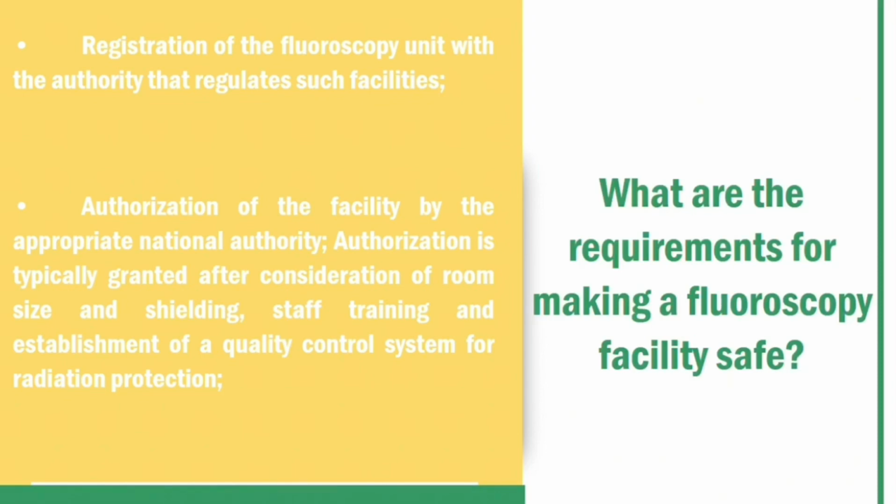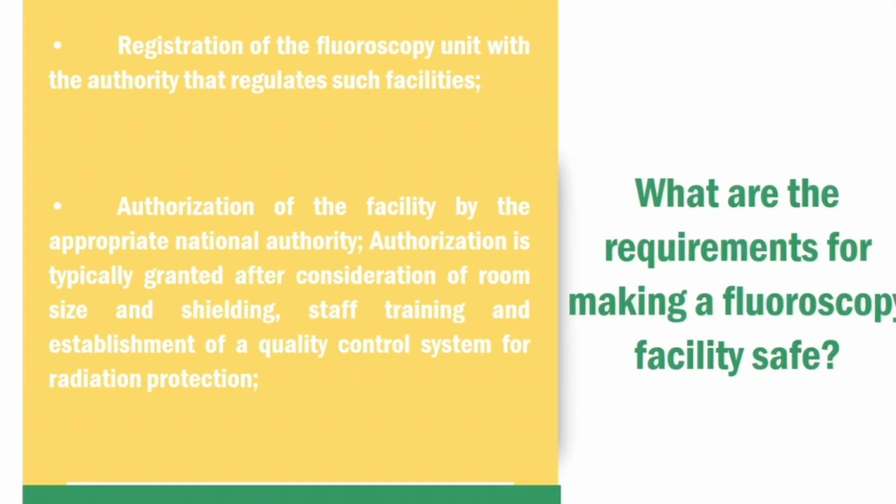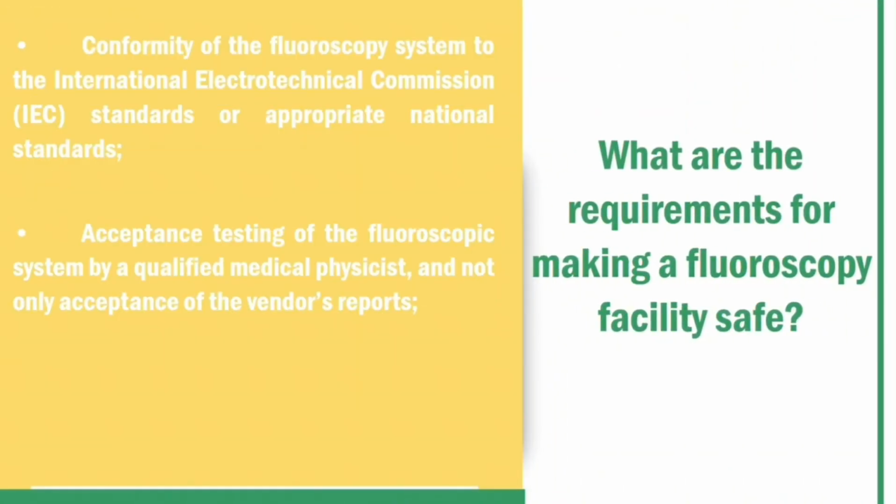Authorization is typically granted after consideration of room size and shielding, staff training, and establishment of a quality control system for radiation protection.